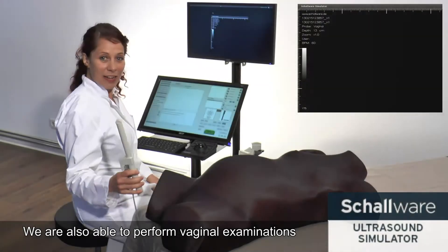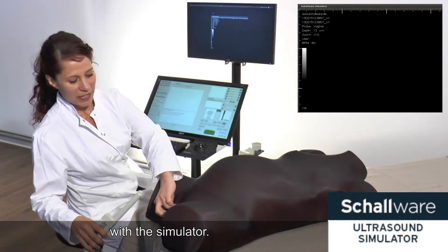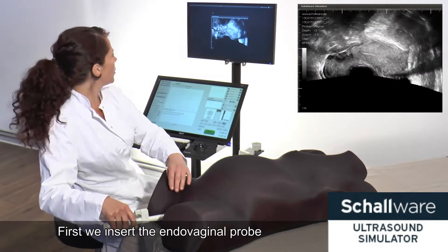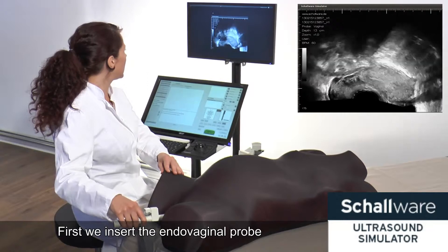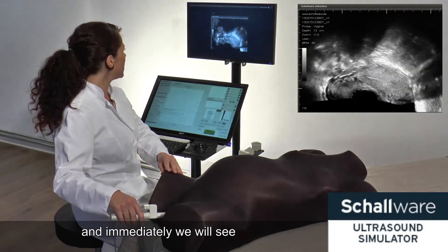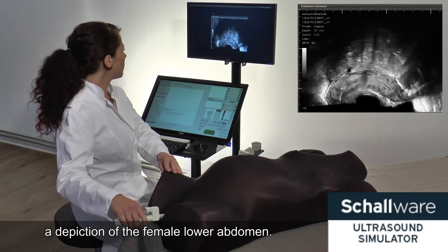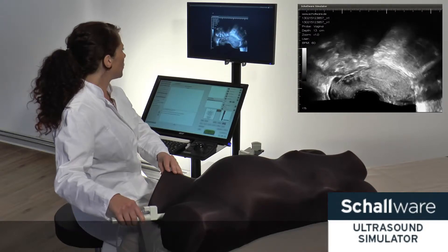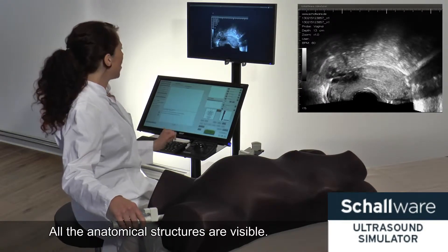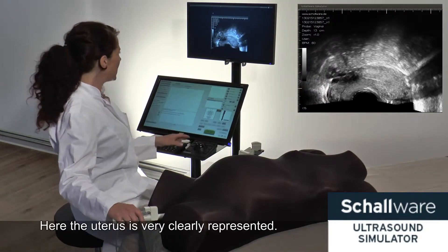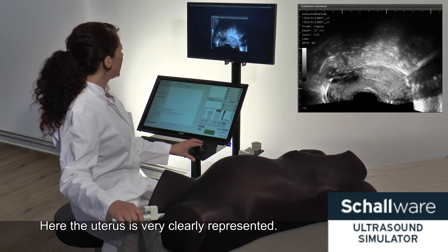We are also able to perform vaginal examinations with the simulator. First we insert the endovaginal probe and immediately we will see a depiction of the female lower abdomen. All anatomical structures are visible. Here the uterus is very clearly represented.